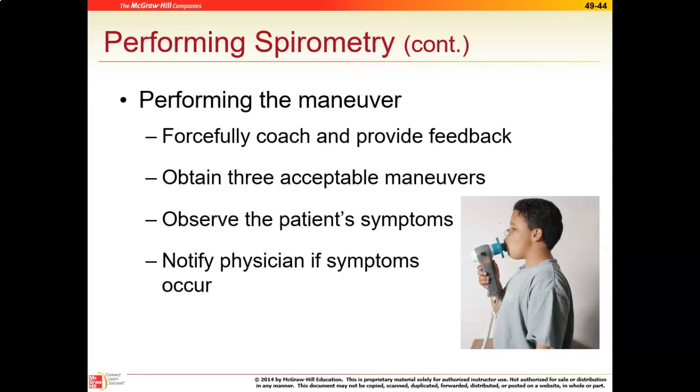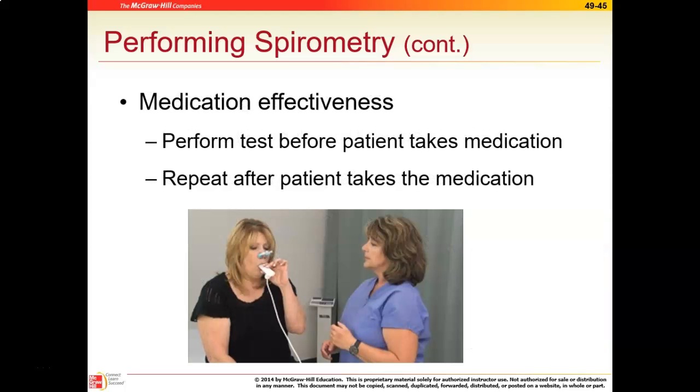The other thing to make sure of is that the patient doesn't lean forward. Sometimes people, when they're struggling to get that last couple of seconds of the air out, their first instinct is to kind of lean forward to help them get that air out, but it's important that they stay upright. Okay. And I think the book shows you the acceptable position versus the unacceptable position.